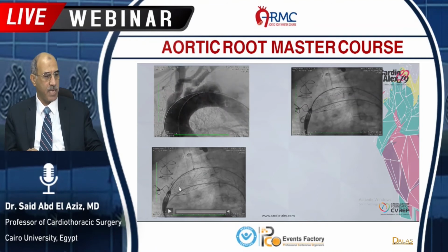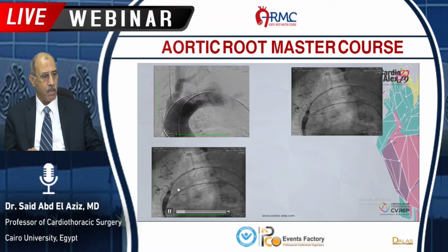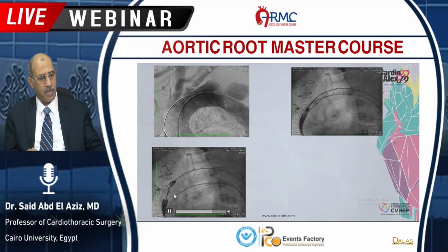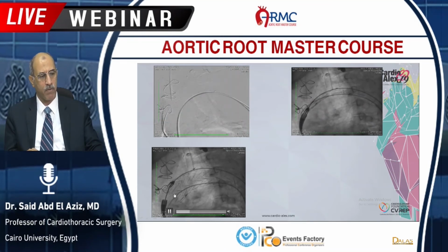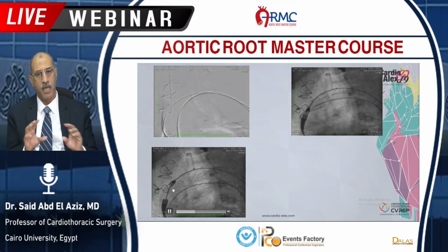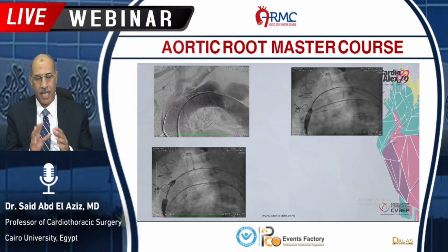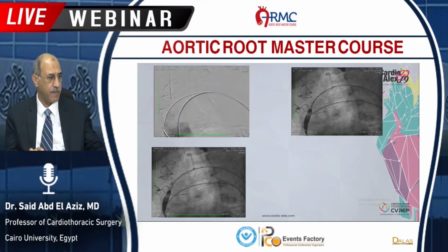After we deployed the stent, here this is the third video, we still have the proximal part of the stent captured, and here we unlock the capture. So this is the last step in the deployment, that the stent is fully deployed and cannot move from its place.